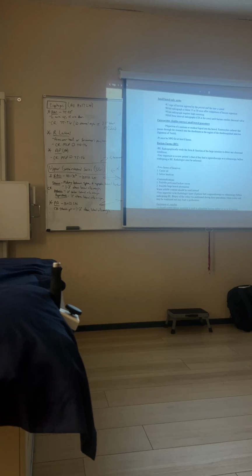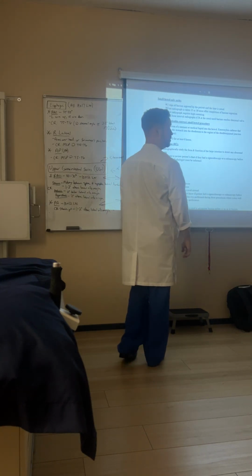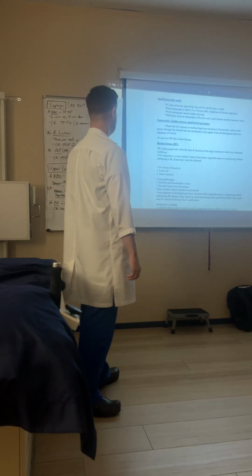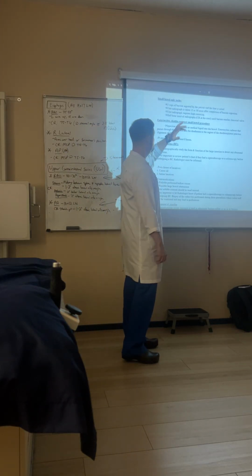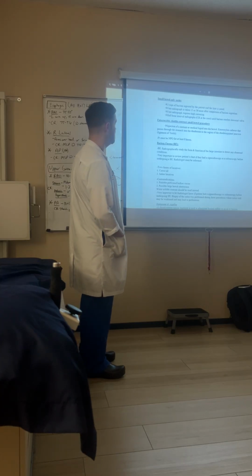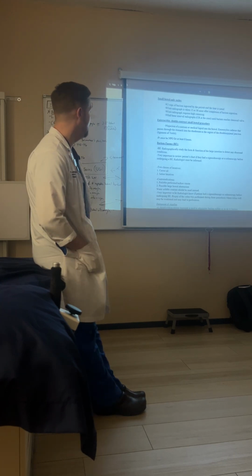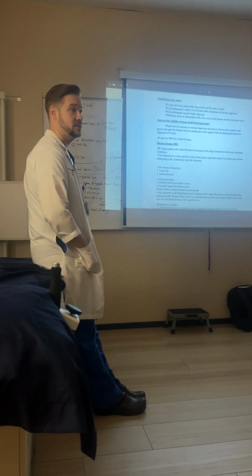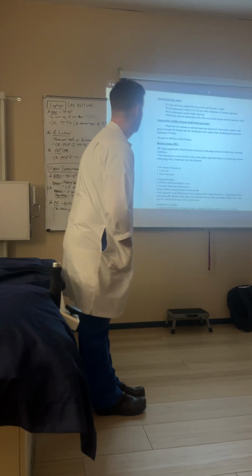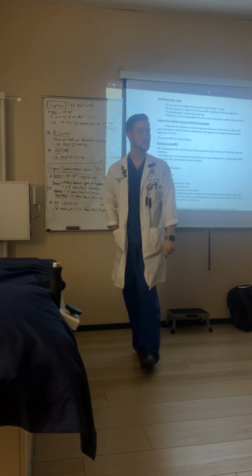Small bowel series. This is, I guess, if you were to do just the small bowel follow through without the upper GI. I've never done that in my time, but if you were going to do that, you would give them 2 cups of barium, and you would note the time that they were finished. First radiograph would be taken 15 to 30 minutes after the completion of the barium. The first radiograph will require higher centering, so you're going to center about 2 inches above the crest for that first image only. After that, the half-hour radiographs will be centered at the crest, which makes them what?